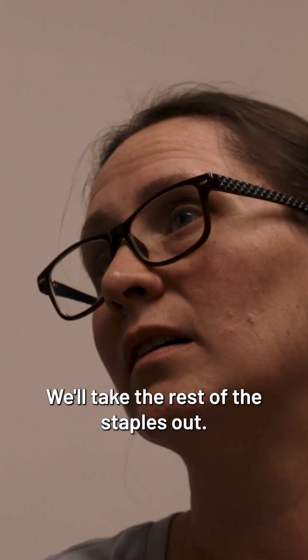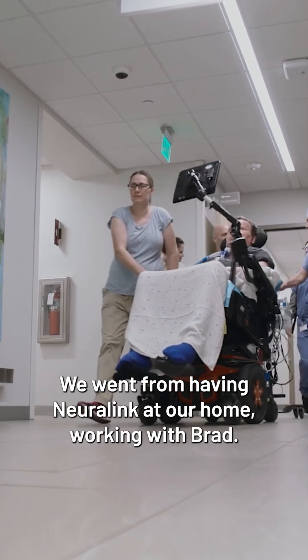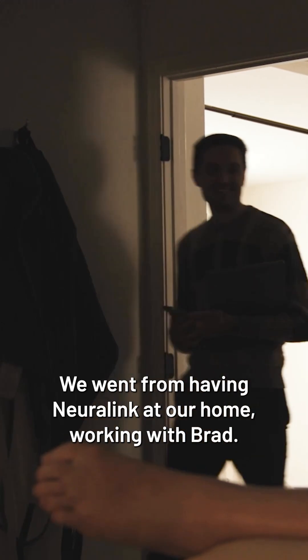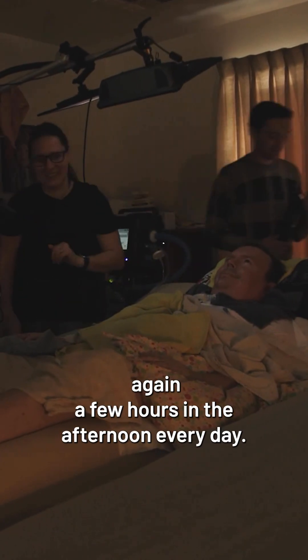We'll take the rest of the staples out. I knew it was gonna be a whirlwind more or less. We went from having Neuralink at our home working with Brad — how's it going, Brad? Good to see you today — a few hours in the morning and then again a few hours in the afternoon every day.